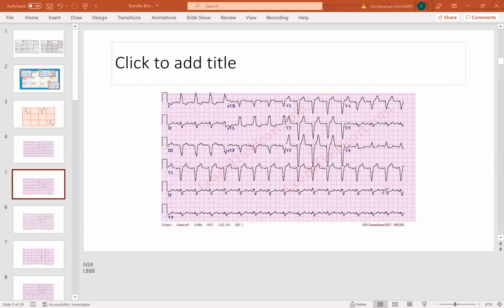So then I'm looking at my QRS width, and what do we got again here? We got some wide QRSs, okay? So wide QRS, I gotta ask myself, do I have P waves? I do, good. That means it's some kind of bundle branch block. All right, so rate. Oh, no. Yeah, I'm right, my bad. So R to Rs, that was my next step here. I started talking, I got sidetracked. So my R to R intervals are regular. So we have a regular rhythm, okay?